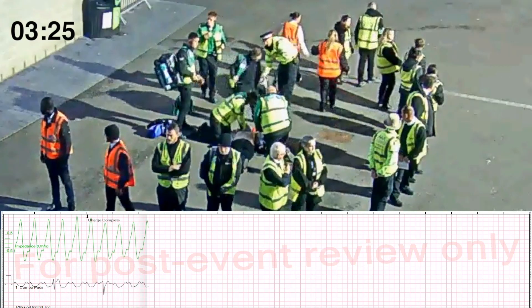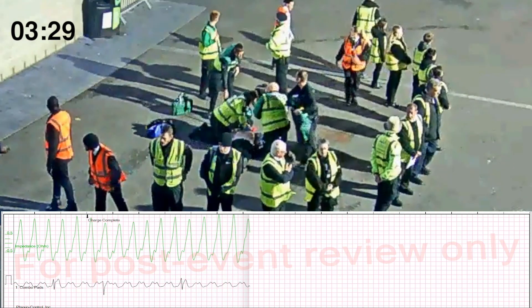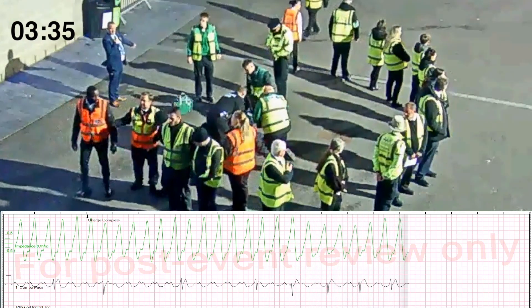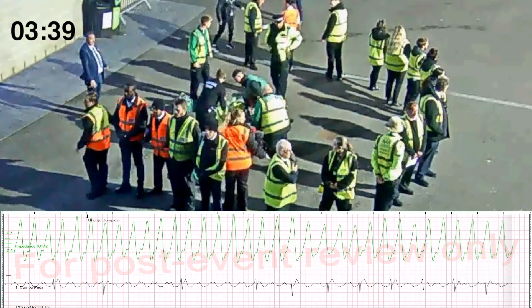Press. Press. Press. Press. Press. Press. Lean over the patient. Keep elbows straight. Use body weight to push.